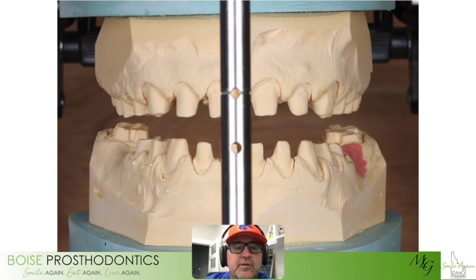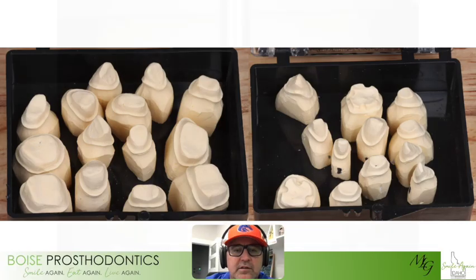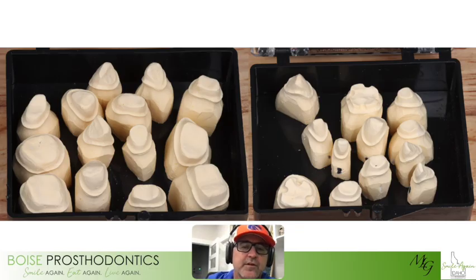So here's those impressions mounted. Here's them using the dies that they trim beautifully so I see the margins. So when they make the crowns, they fit the margins perfectly. When you have a crown made, you do not want any open margins. That's a space between the crown and the tooth. And there are techniques that can avoid that and minimize it to the best possible. It just takes diligence and a level of perfection or desired perfection that you're willing to go through.